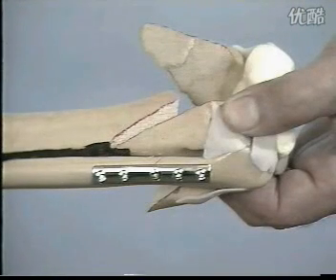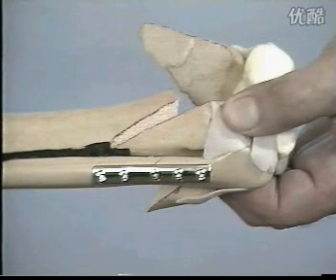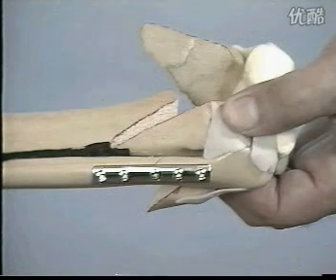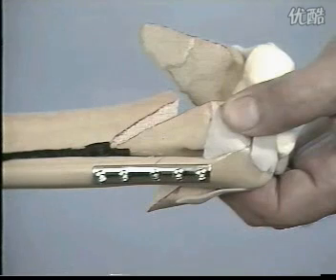In a second phase, we expose the tibia with a longitudinal incision which begins lateral to the tibial crest, proximal, and curves slightly distally towards the medial malleolus. The tendon of the tibial anterior muscle and the dorsal vessels of the foot are raised and expose the lateral surface of the distal tibia. The medial fragment with the malleolus can be rotated outwards to provide a better view of the tibio-talar joint.